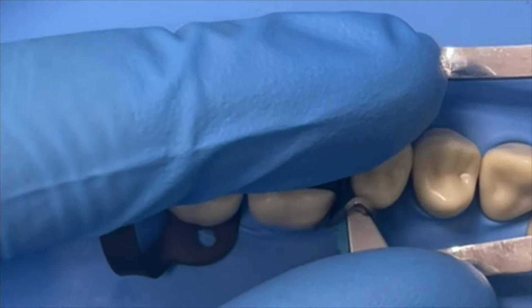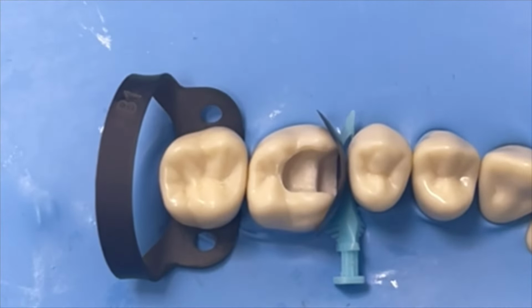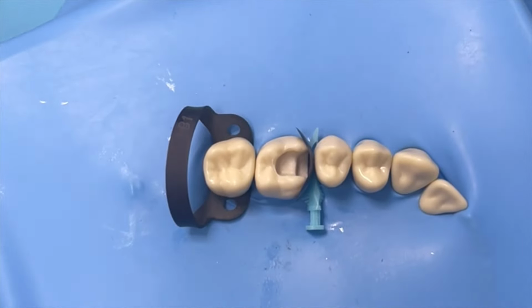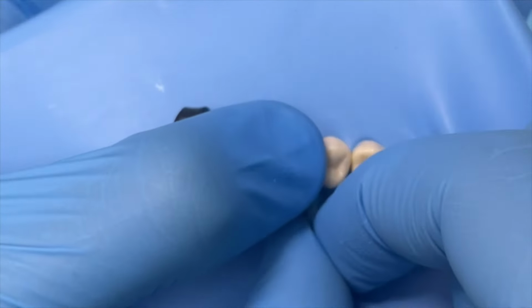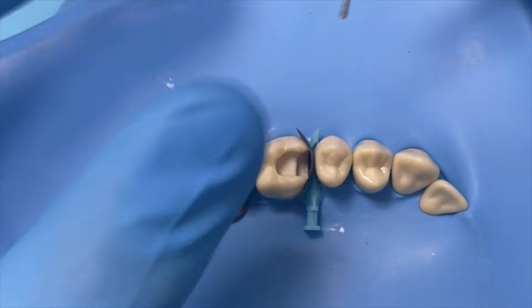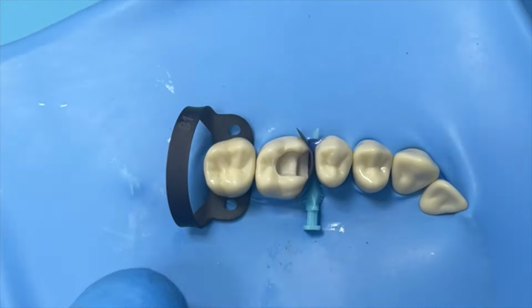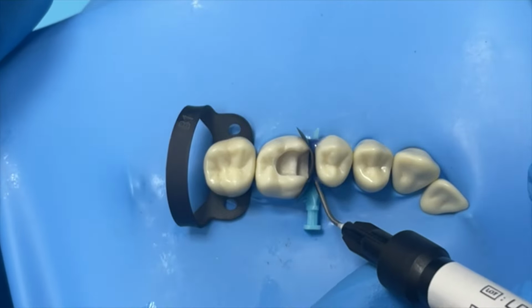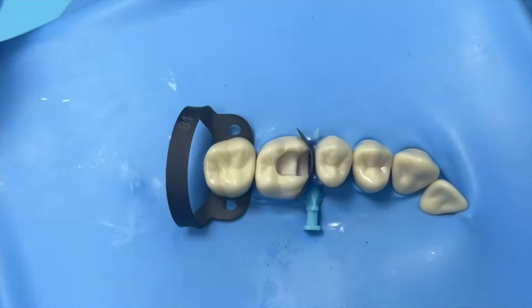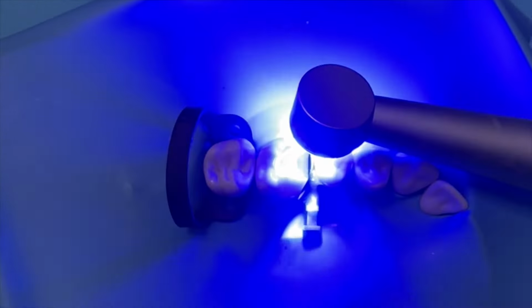Okay, I'm just going to show you another little trick of how I've been using these. They've only just arrived, but I've been using a prototype for a few months. One of the things I quite like to do is control the ring in terms of how much it's going to deform and press in. So what I've been doing is adding a little bit of liquidam into the embrasures. You can think about those rings where you are picking the different insert to go into these areas. So kind of taking the fitting process out, I'm just putting in that liquidam, and it's going to block up the embrasure space and stop the band from collapsing in.